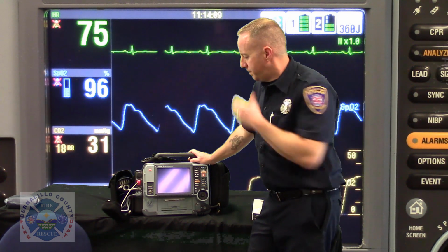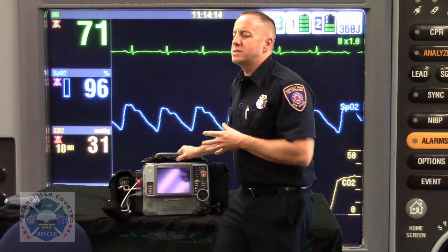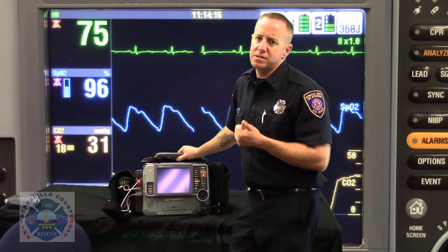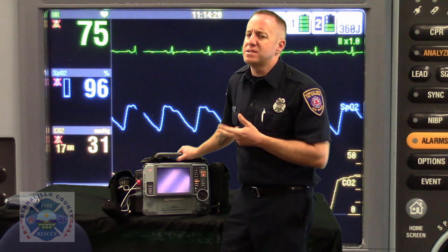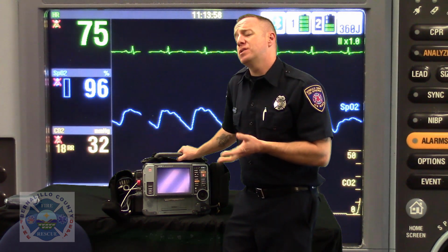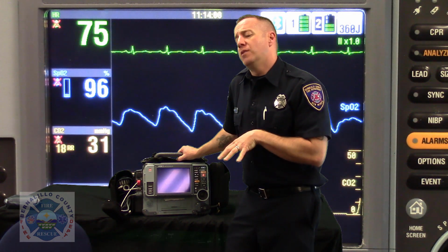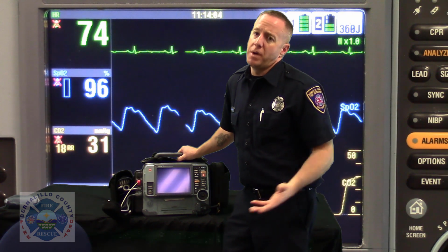That's important. Now, you'll notice also that the patient's right side is still accessible for IVs, temperature, BGL, all of those other invasive procedures. And then when the patient is transitioned from the home to a gurney, and from the gurney to the back of the ambulance, their left side is still available for serial monitoring.